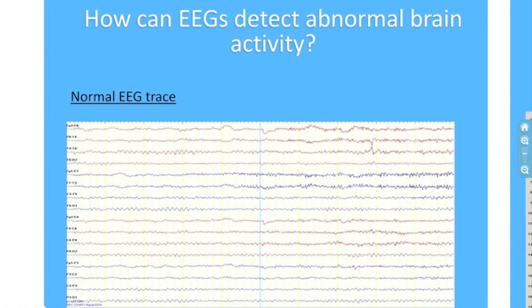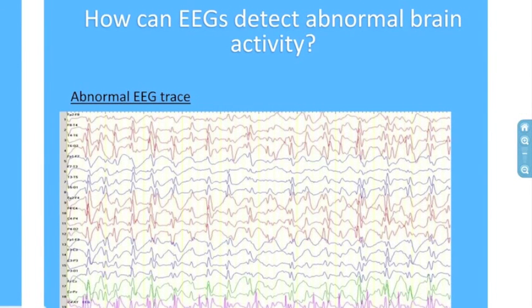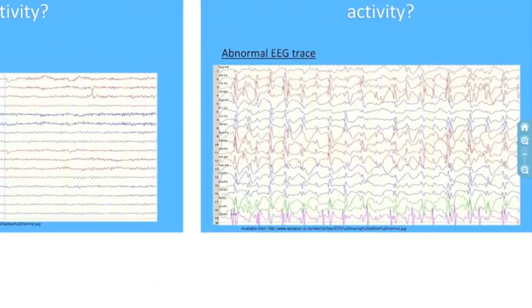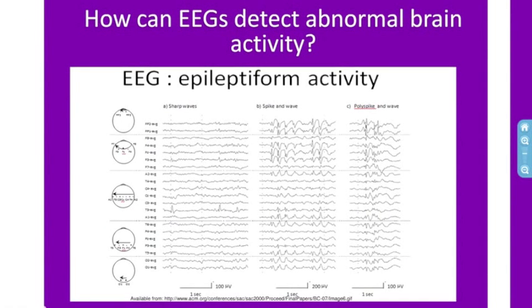So how can an EEG detect abnormal brain activity? This is how a normal EEG trace looks like; the frequency of waveforms depends upon the state of activity of the brain. In contrast, this is how an abnormal EEG trace looks like. Different abnormalities within the brain show different characteristic changes. For example, in epilepsy, characteristic sharp waves, spike waves, and polyspike waves are seen. These may be either focal, lateralized, or generalized, indicating the origin of the abnormality.